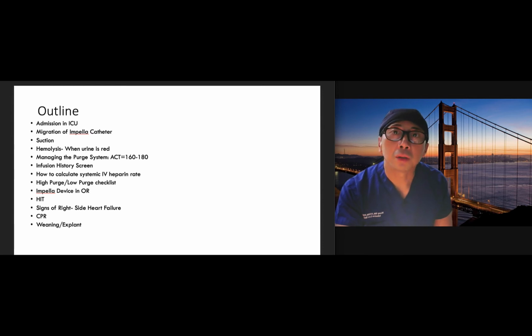What about if the patient is going to the OR for either explant or surgery? Usually the Impella device goes to the OR with the patient for surgery, so what do they do with the machine? They might not know what to do with that. So you need to be the subject matter expert there, because you're transferring your patient from the ICU to the OR. So you need to pay attention to the video.